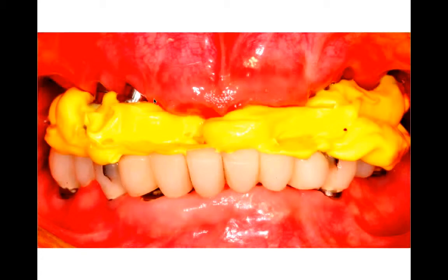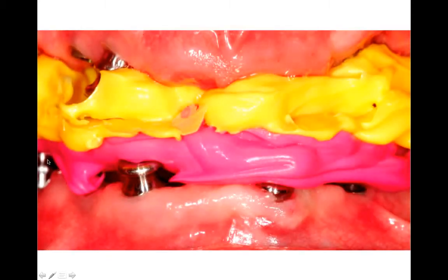So if we go back to the mouth with that same record, at this point we leave this in the mouth, because it's not going to be easily removable, and the patient can open and close. Then somehow we need to orient for our occlusal vertical dimension. To me the easiest way is to remove the anterior section of this and inject against the tissue here to maintain our vertical. Then the patient can open, we can remove the remaining provisional, remove the abutments, place our bite posts, and inject the material over the bite posts.